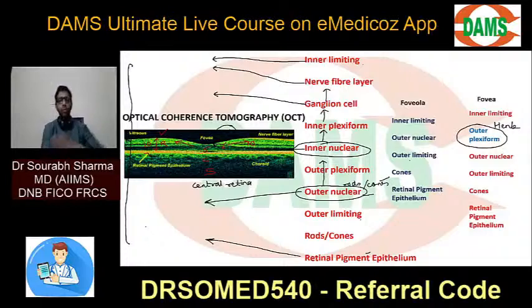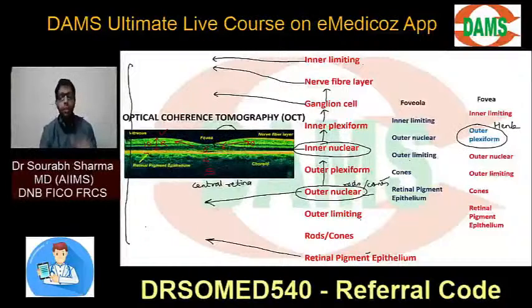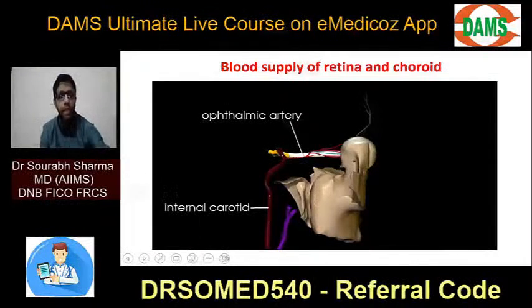So I have told you about the basic structure of the retina. I have told you the basic layers of the retina and how they are represented in optical coherence tomography. Now to understand angiography, in angiography we should talk about the blood supply of the retina and choroid. Very important, because everything in angiography is based on the blood supply and the barriers of the retina.